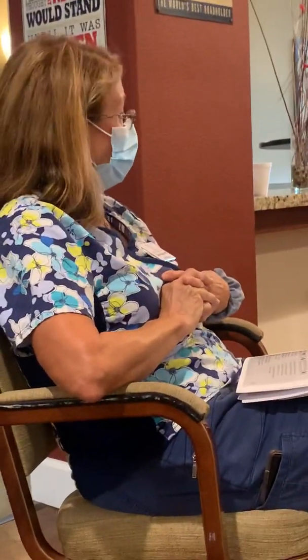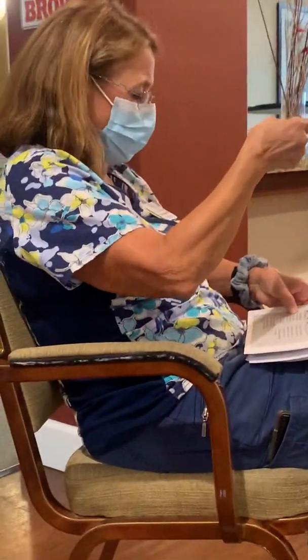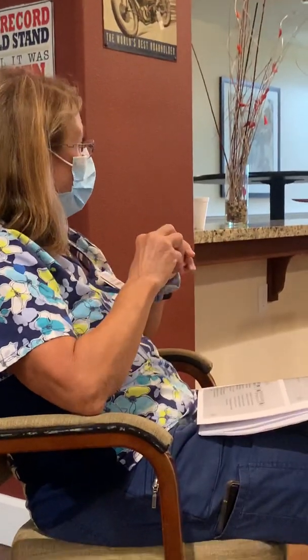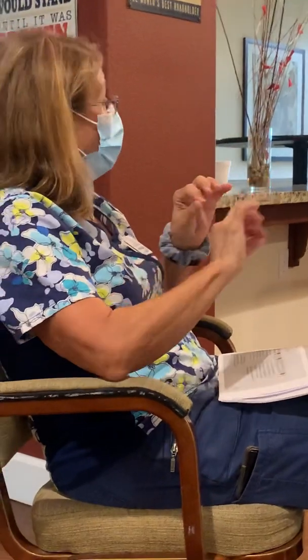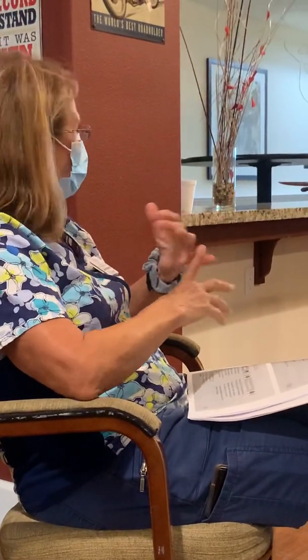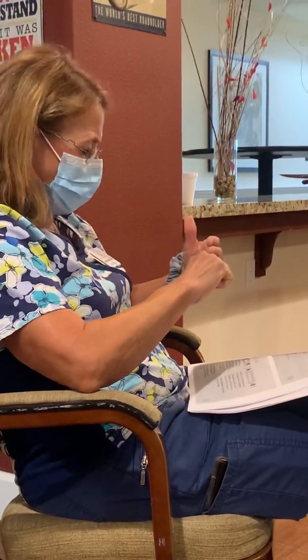So what we're going to look for in a male patient if there's a problem is inflammation, swelling, or drainage, especially around the penis and down the first part of the tube. If possible, ask the patient whether there's any burning or discomfort. There's always going to be some discomfort, especially more for gentlemen than there is for women, simply because it's a longer urethra up in there and there's more to pull on, so they are going to feel a little more discomfort, just as long as it's not extremely painful or you don't see any bad discharge or change in the urine.